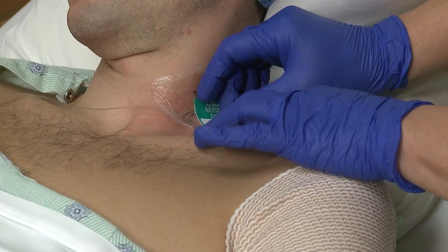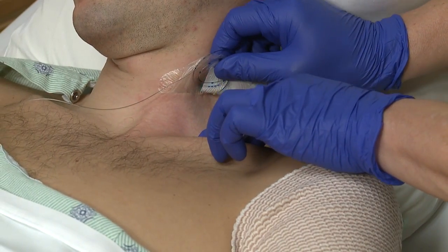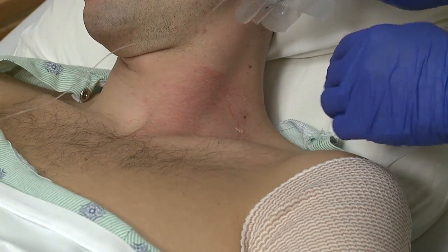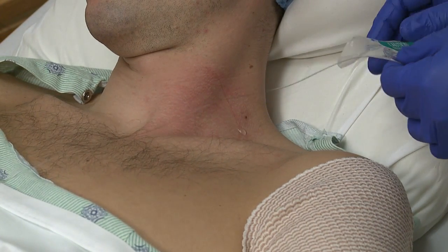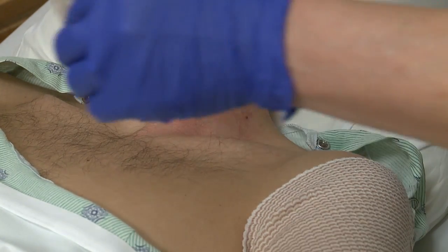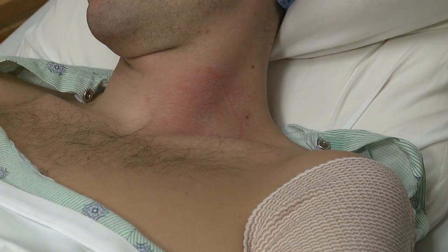Simply peel off the dressing and the tape and the catheter just slides right out. If it doesn't want to come out, or if it hurts to pull it out, just leave it in place until you're able to speak to the anesthesiologist, and they can help you through that. Once the catheter is out, the whole thing can simply be thrown away.